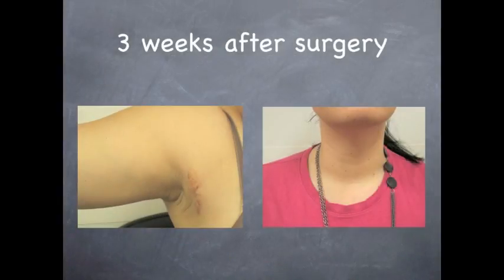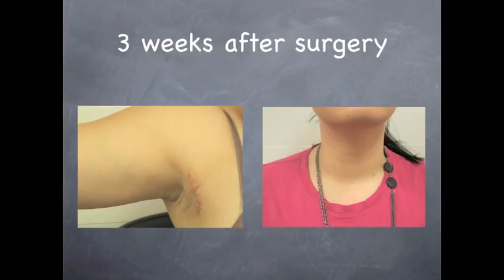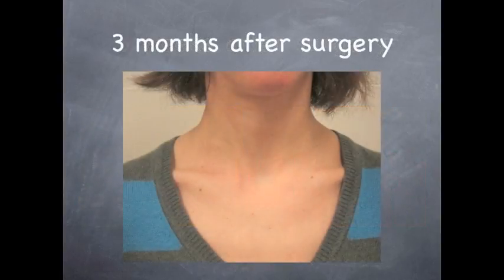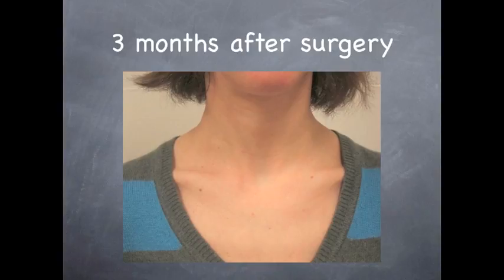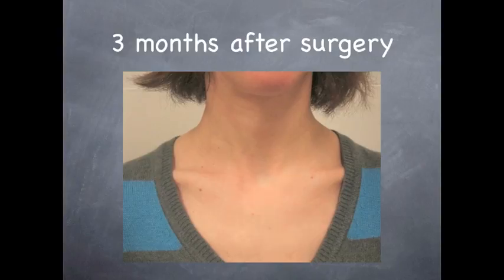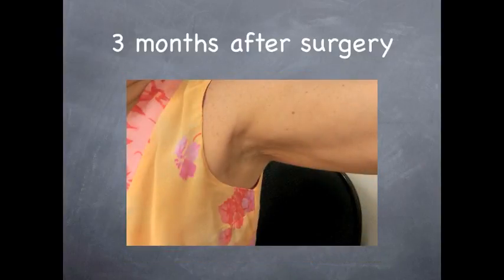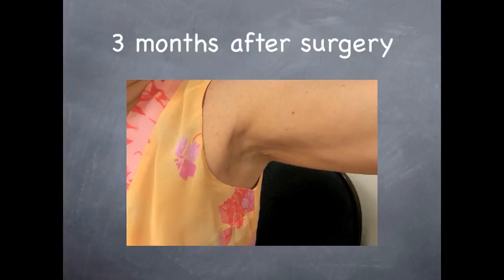Three weeks after surgery, the axillary incision is well-healed, and the neck has a normal contour. Three months after surgery, there is no evidence of having had thyroid surgery as there is no scar on the neck. In addition, the axillary scar is well-healed and practically undetectable. With the arm in the down position, it is in a hidden location and not visible.